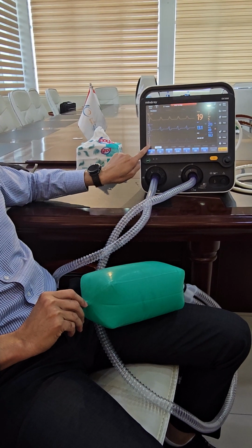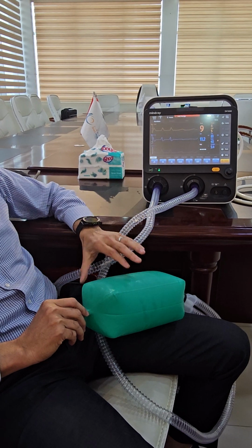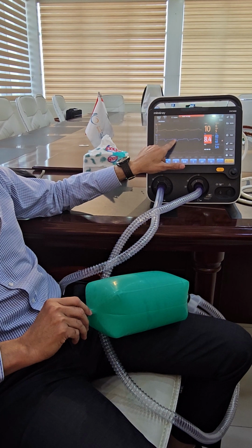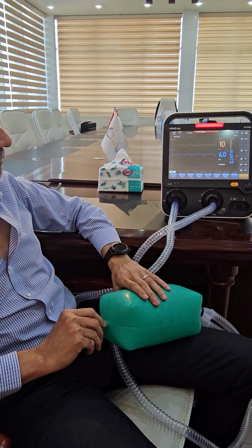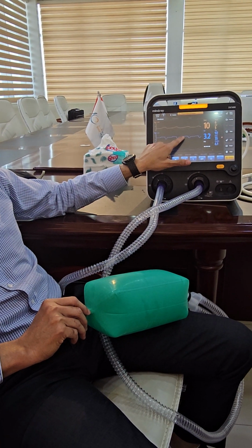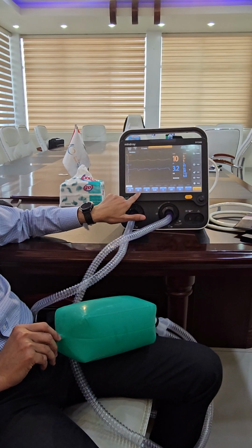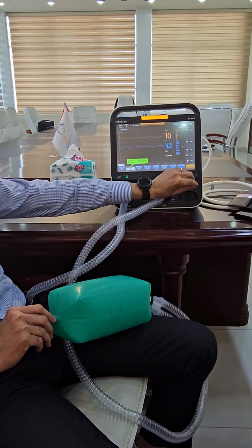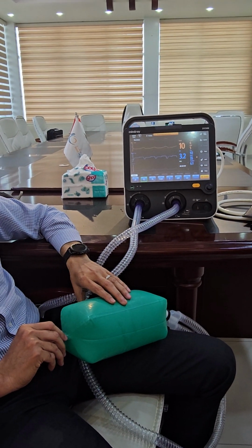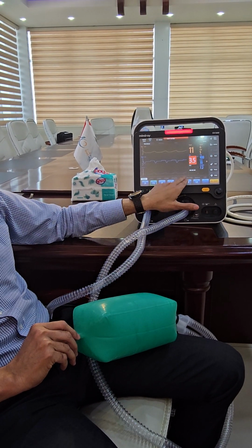Let's go to volume. Look at it. What happened to the wave? It's just pressure. What happened to the wave? Decreased, not because I decreased it, but look at the wave. Plateau. Let's make the plateau bigger. There is a plateau, plateau time. And of course, the ventilator will take time to adjust, but the pressure needs more pressure.